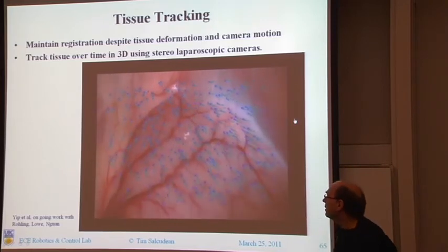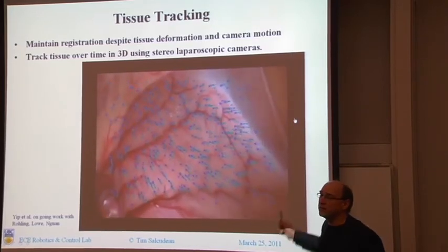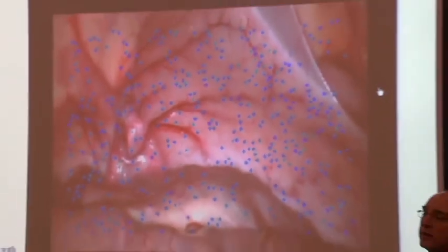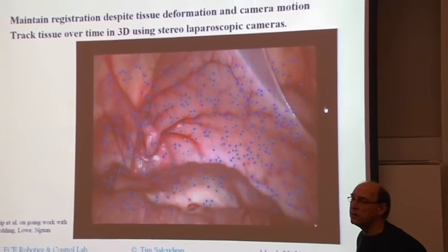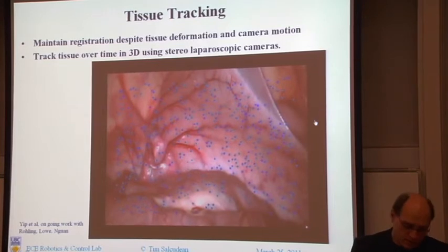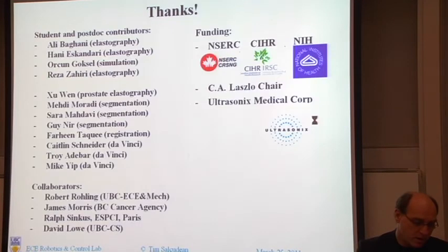This is running at about 1.5 seconds per frame in MATLAB, but we have another method which I can't talk about yet, which can do that 10 times faster. So when we do a C implementation, we'll have this running without GPU acceleration at a reasonable rate.